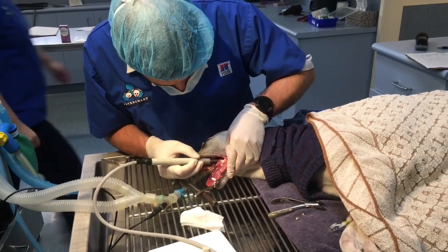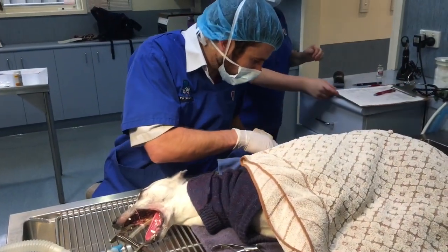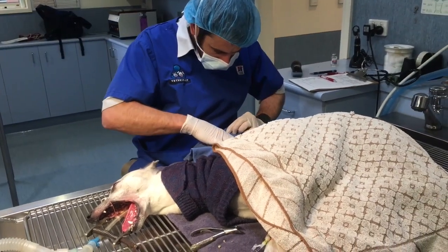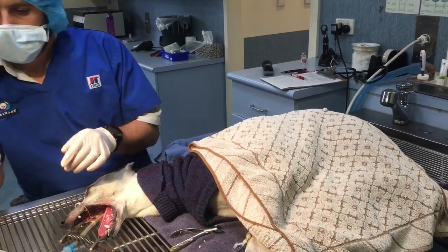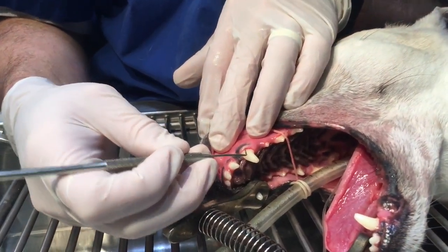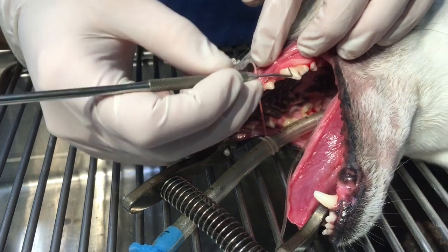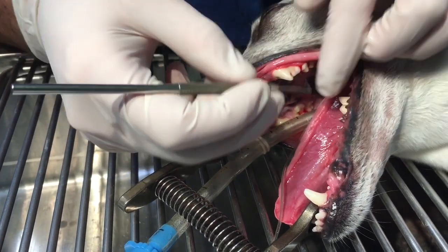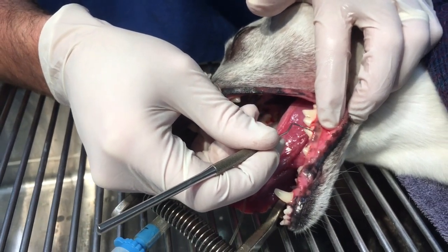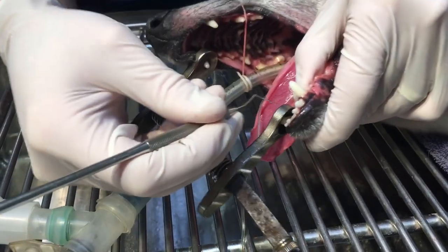They all look pretty good and clean now. Grab my little probe — same thing as what the dentist uses. We just go around here and have a look and see how deep the gum recession goes. For the most part it looks like Rosie's sitting at about threes for those, twos for that one, two and a half around there — about threes on that canine on the inside. Down here — less than one. Twos. And getting down to threes on that canine on the inside. I'm going to record this all down on our history. The ones we really need to watch for are the three mil ones around the canine and up the back.